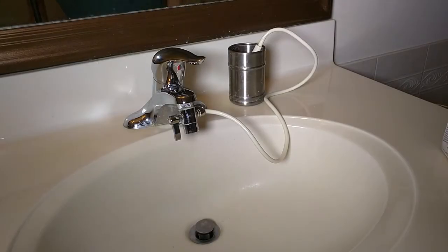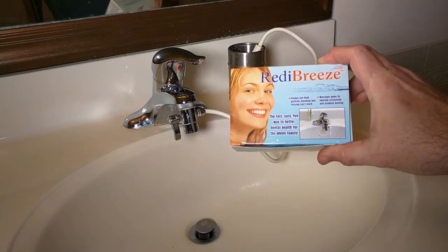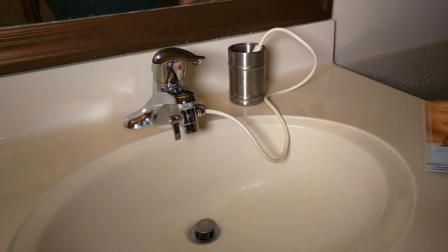Hello again, this is Robert Veach, and this is my video review of a product called the Quick Breeze, or the Oral Breeze, or the Ready Breeze. The first product was called the Ready Breeze, and it has had those name changes over a couple of years, but it's basically the same product.